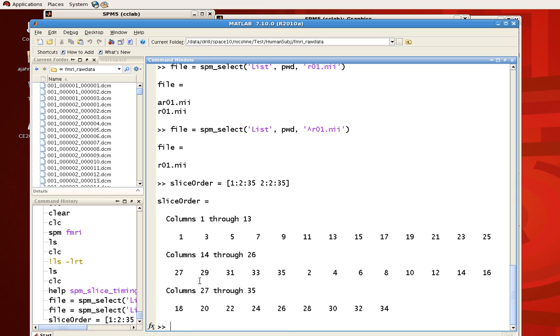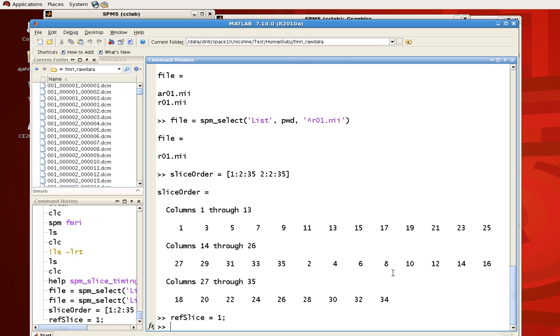You can see that the slice order is now 1, 3, 5, 7, 9, and so on, until it gets to 35, then it goes back and it collects 2, 4, 6, 8, and so on. And for our ref slice, let's just call that 1.